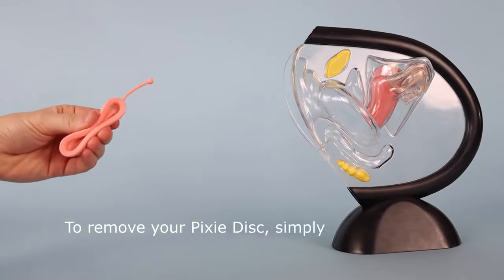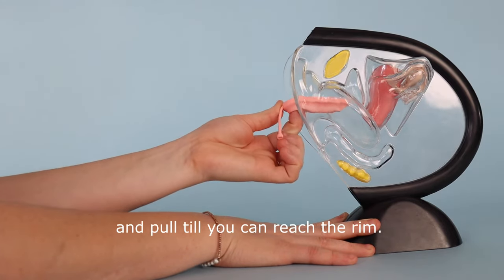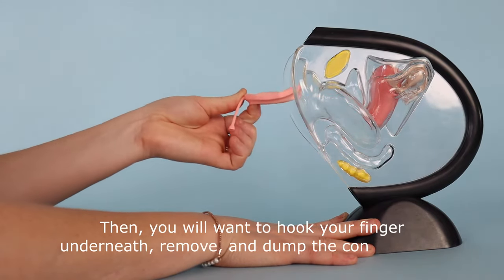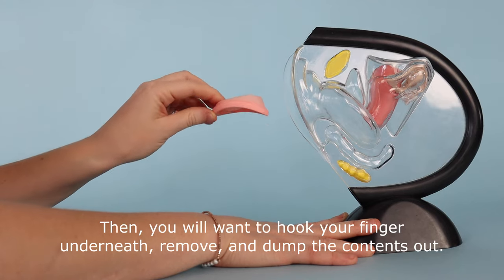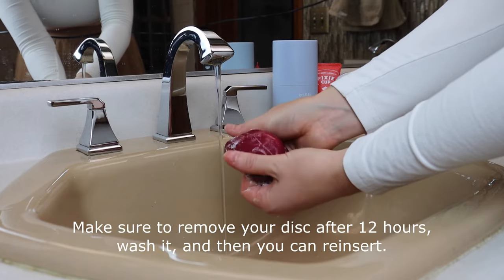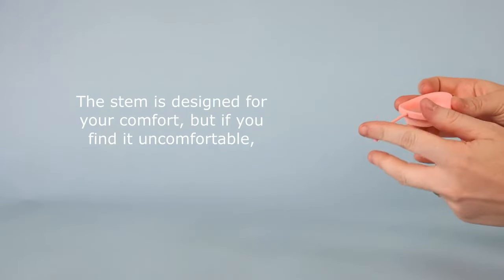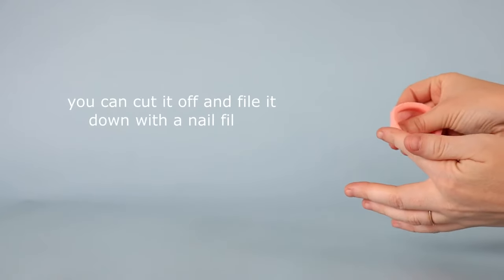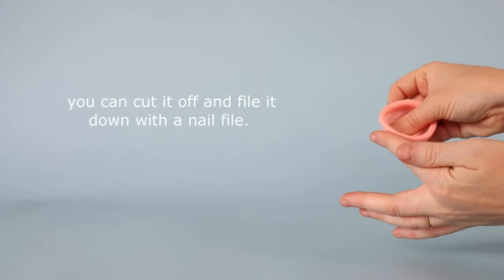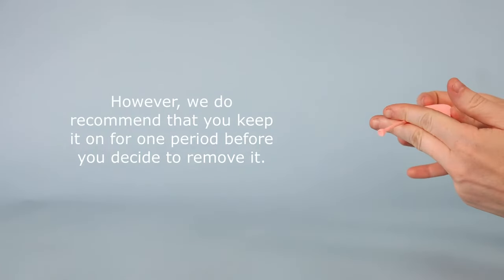To remove your Pixie disc simply grab the stem and pull until you can reach the rim. Then you'll want to hook your finger underneath and then remove and dump the contents out. Make sure to remove your disc after 12 hours, wash it, and then you can reinsert. The stem is designed for your comfort but if you find it uncomfortable you can cut it off and then file it down with a nail file. However, we do recommend that you keep it on for at least one period before you decide to remove it.